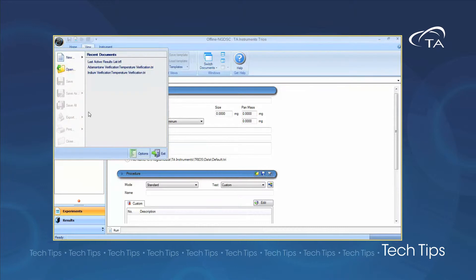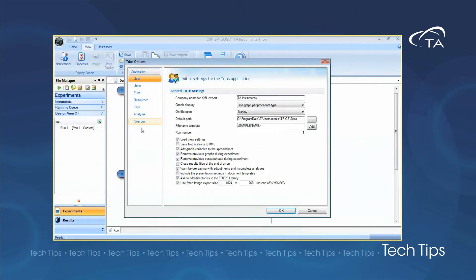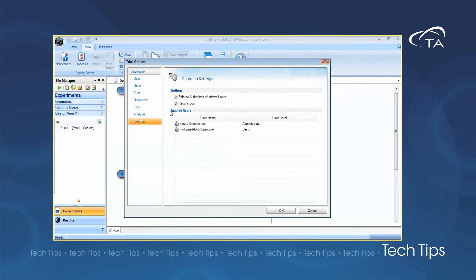In TRIOS, the administrator user level can set the Guardian options to include access and restrictions to the defined authorized user list, and select in the results log to save a record of the analysis events that occur after file creation within the data file.